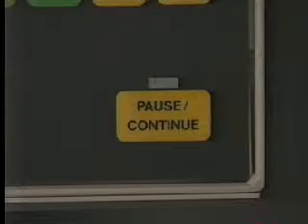Warning and operator attention alarms require you to be aware of the system's current condition. They are indicated by an audio alarm and a flashing yellow warning LED.